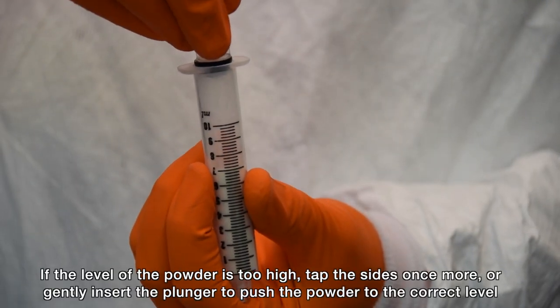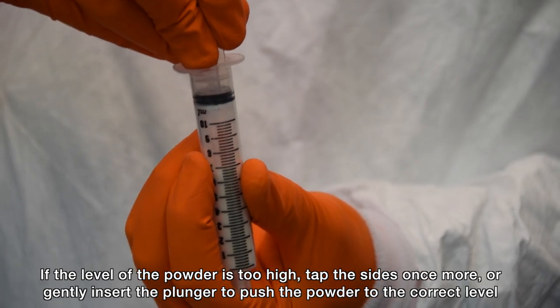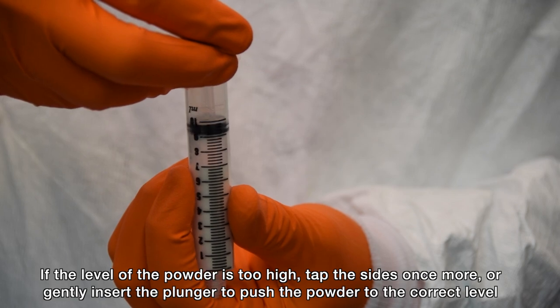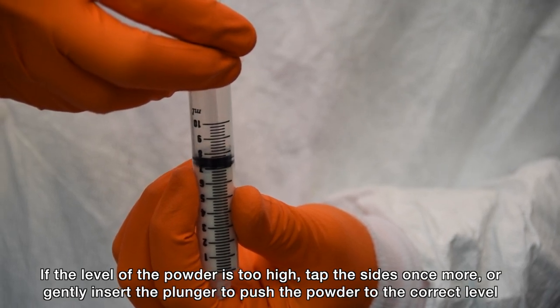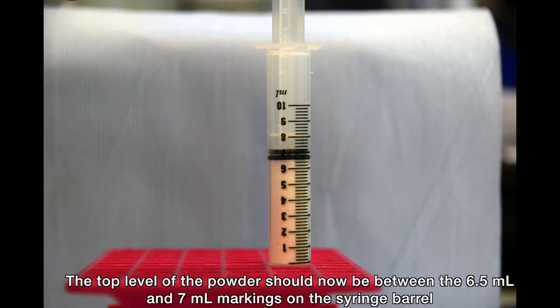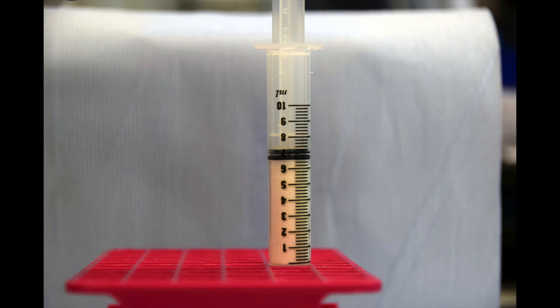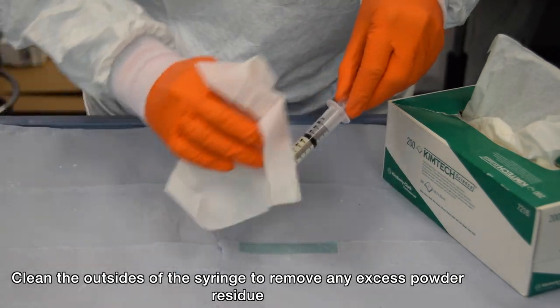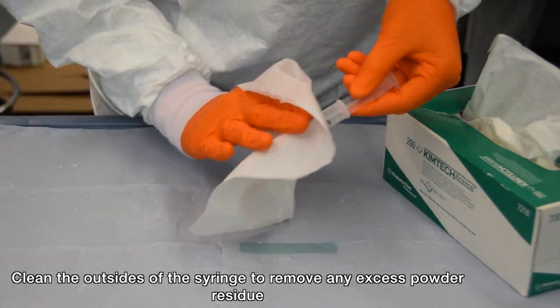If the level of the powder is too high, tap the sides of the syringe barrel once more, or use the plunger to gently push the powder down to the correct level. The top level of the cellulose powder should now be between the 6.5 and 7ml mark on the syringe.